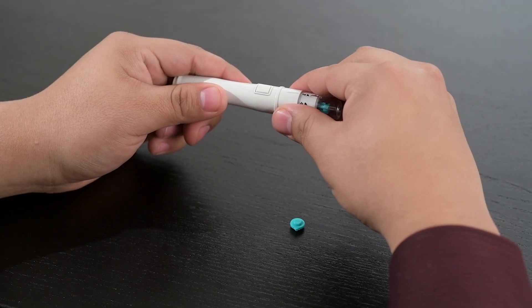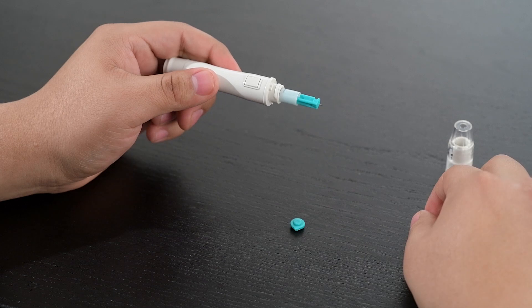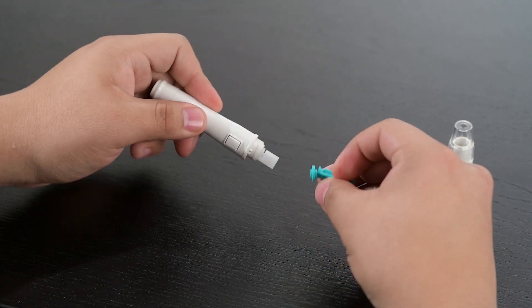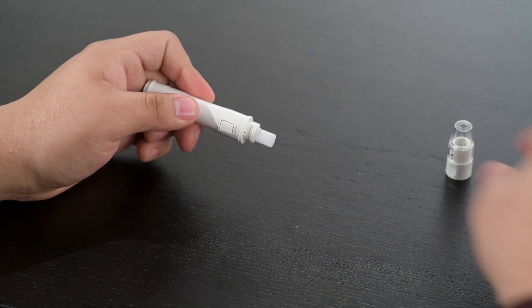Unscrew the lancing device's adjustable cap. Place the protective cover on the lancet and dispose of it and the test strip in a proper puncture-proof or biohazard container.